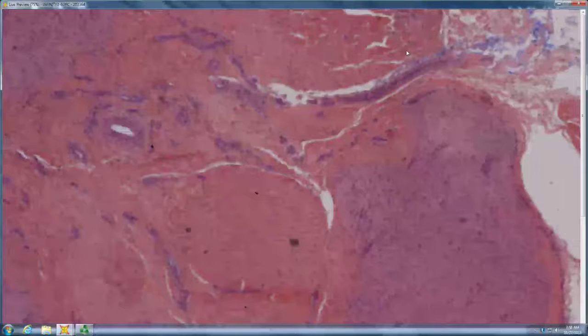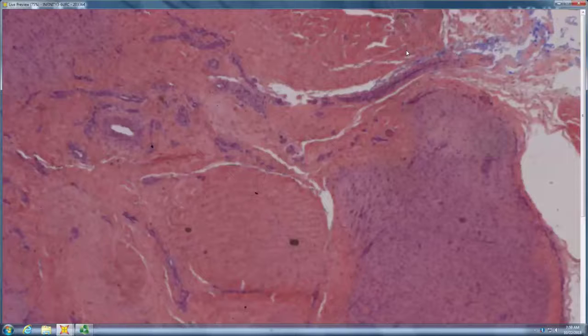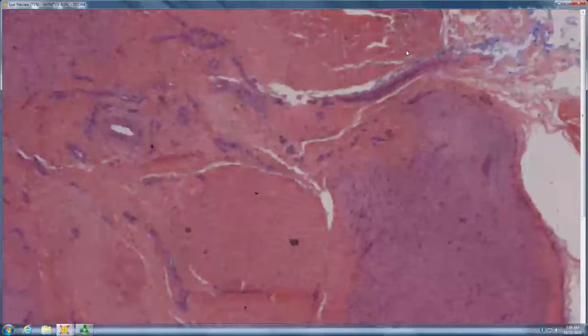Usually palmar or sole. The palmar tends to be more linear contraction, whereas on the sole in Ledderhose disease, you get real nodules. So would this be more typical of the abdomen, like a desmoid, you mean? Not desmoid, because desmoids are more uniformly cellular throughout. But it looks the same, right? Yeah, it fits within the spectrum of fibromatosis. Some consider desmoid to be a super, super low-grade fibrosarcoma because they tend to be more progressive.